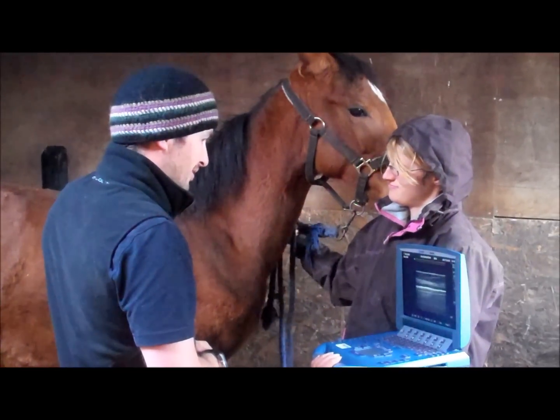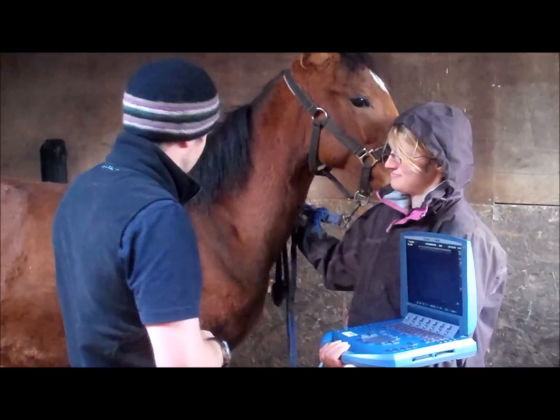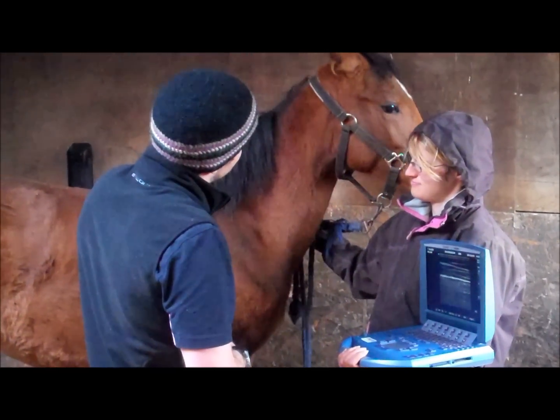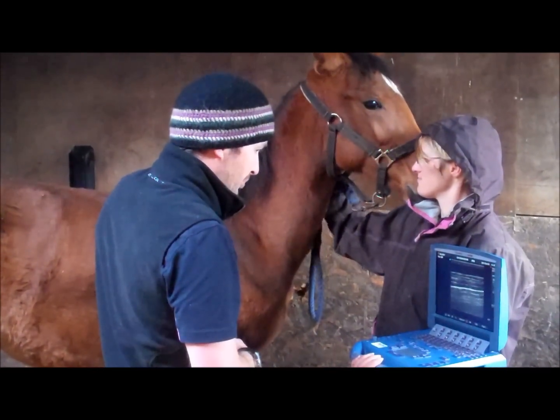The beauty of this scanner is that we've got a good battery pack on it, so it's just me and this cable — we don't have any other cables to worry about. And for somebody as well behaved as you are, it makes it a very simple, quick and easy process.